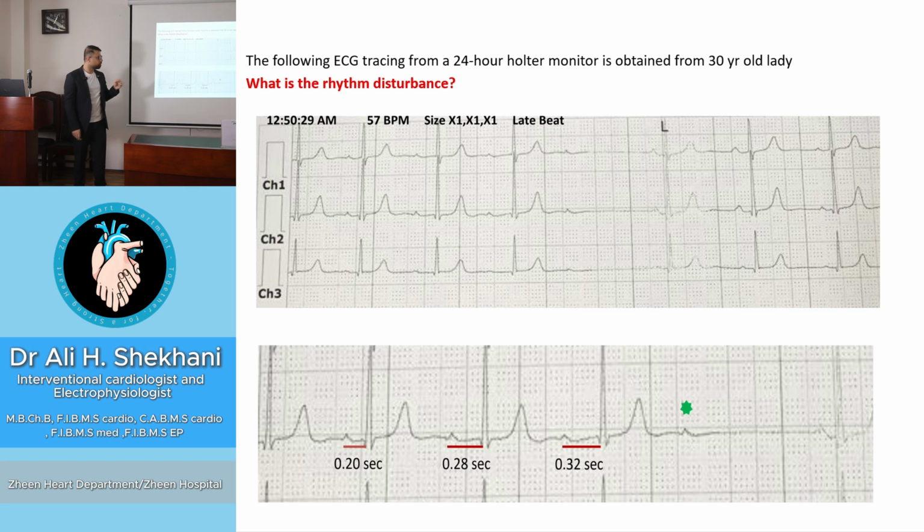The only indication for pacemaker is if the patient has symptoms. Otherwise, it is very benign and doesn't need anything.